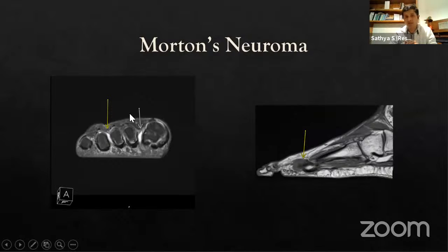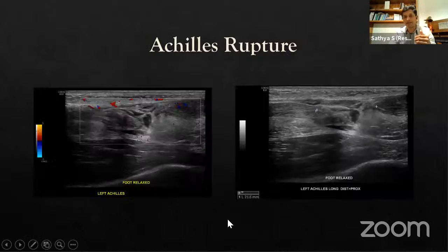But this person is also having some bursitis present between the first and the second, and we are able to see active inflammation in this area and fluid presence also. So MRI guides us to understand what is happening. Quite often we think it could be sesamoiditis or some other problem, or even a plantar plate injury, but yeah, this helped us a lot to identify what is happening, and reading of images is very important.